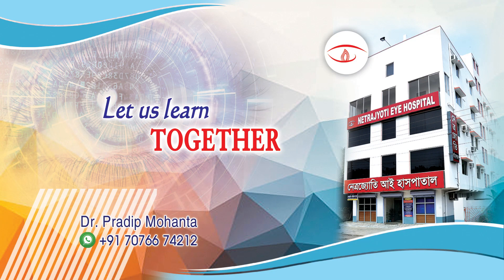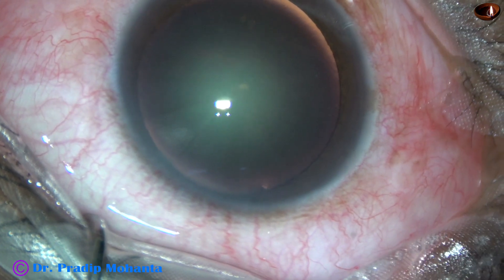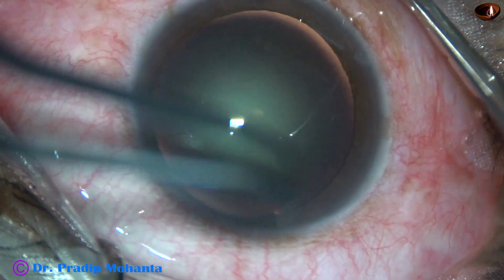Friends, welcome to my workplace at Ranaghat, West Bengal, India. This is a manual small incision cataract surgery. Let us observe the surgical steps.